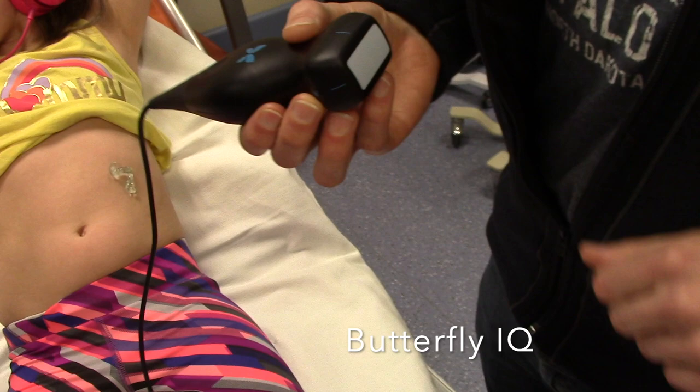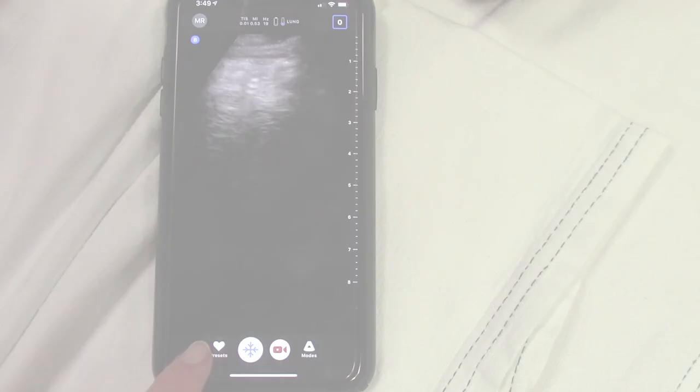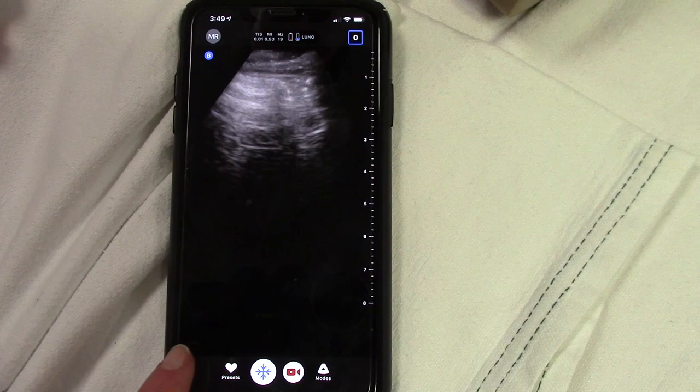So this is the Butterfly IQ, handheld Butterfly IQ. We have absolutely no financial disclosures, but we just wanted to show you a couple of options here. The first thing you're going to do is start by clicking your preset — we already have it hooked up on lung, so we're going to select that as our particular mode.